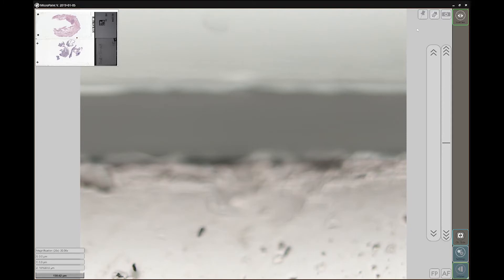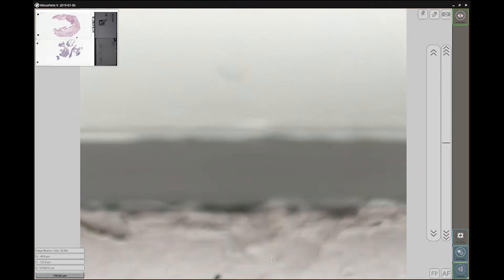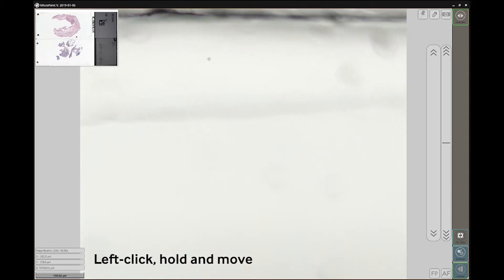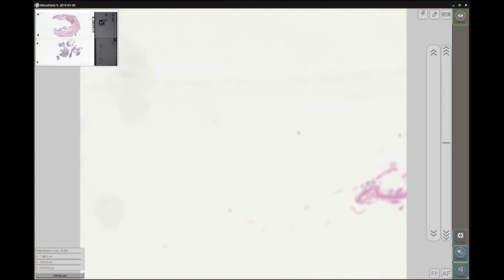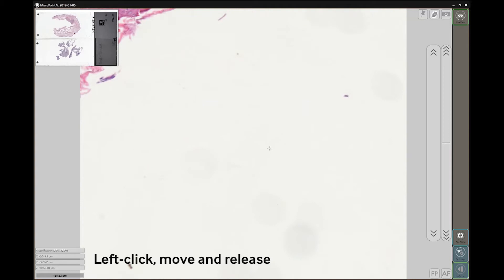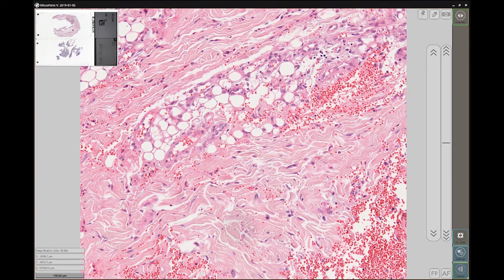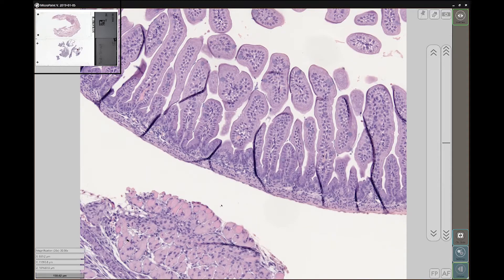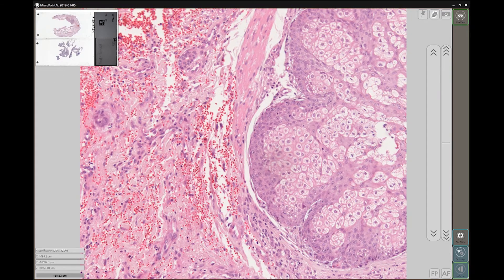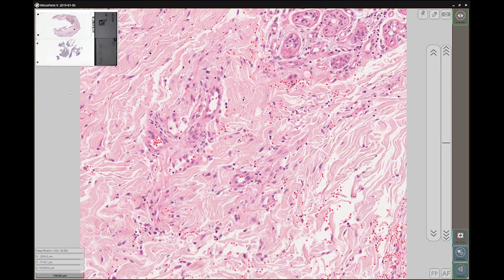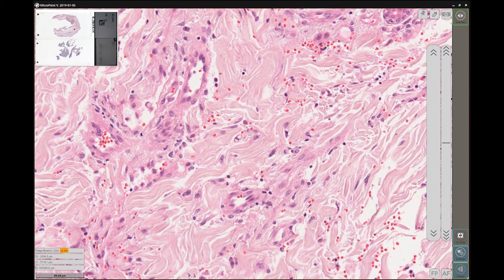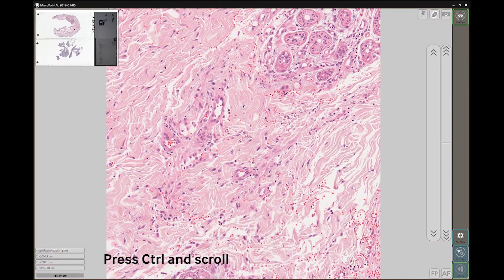Navigating this mode is quite simple. If you have a touch device, simply use your fingers to do so. Or we can do it with the mouse — simply select, hold it down, and move the mouse where you want. The second variation of moving in a direction is called flick: while clicking on the left mouse button, move it quickly and release. We can also move in the slides quickly by the overview image, by simply clicking the region of the sample we want. There is also an option to zoom in and out by pressing the control key and scrolling the mouse wheel.